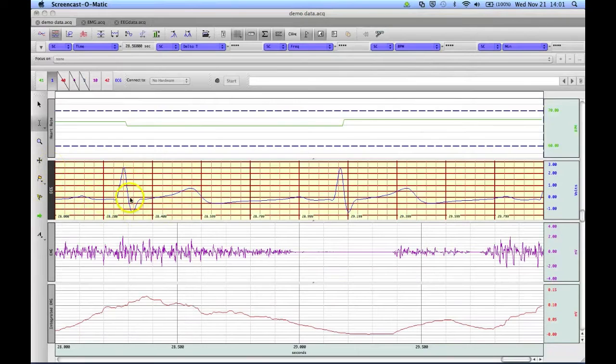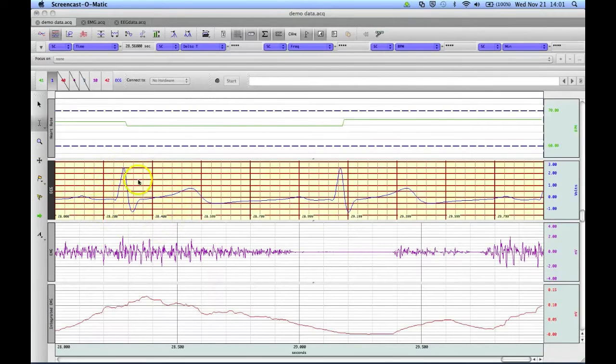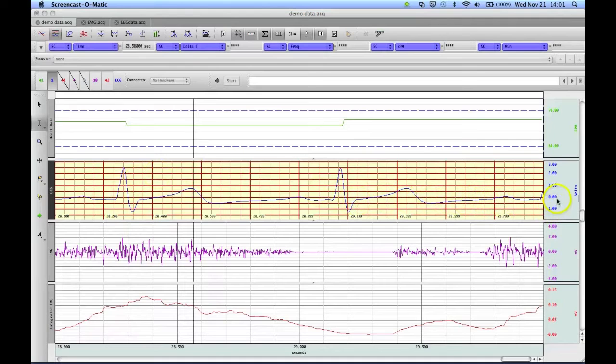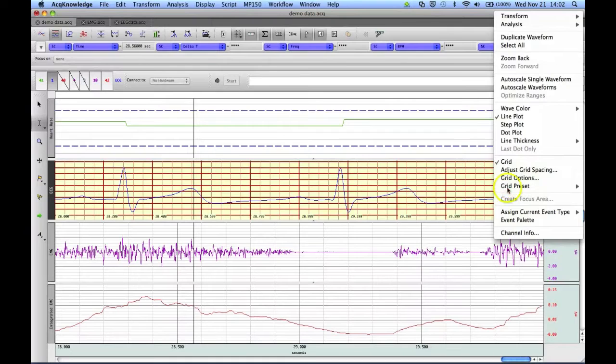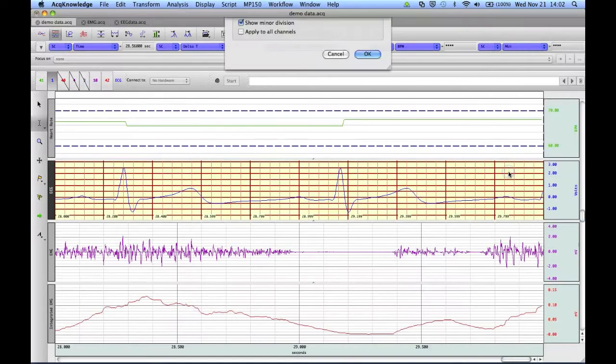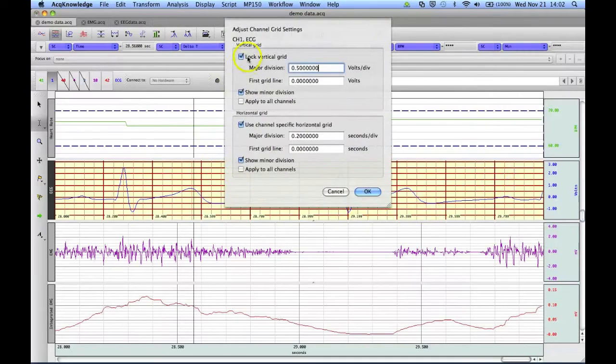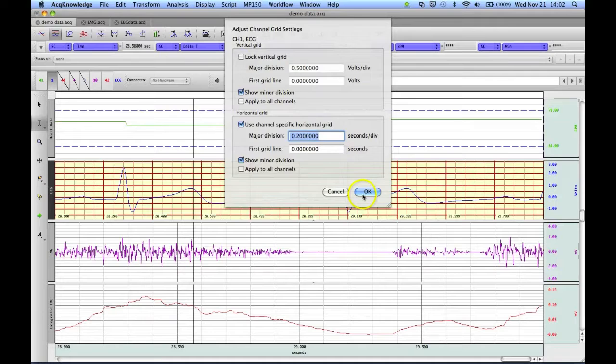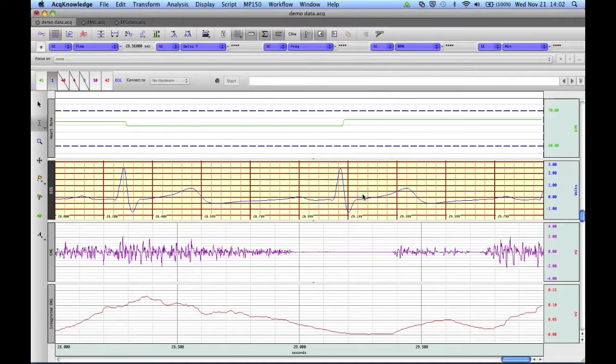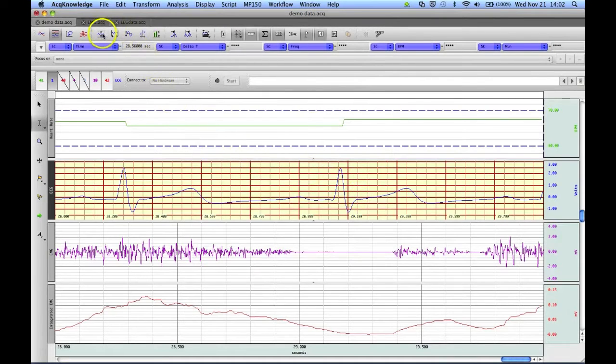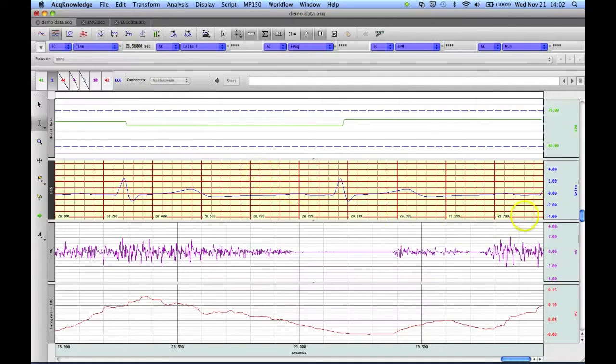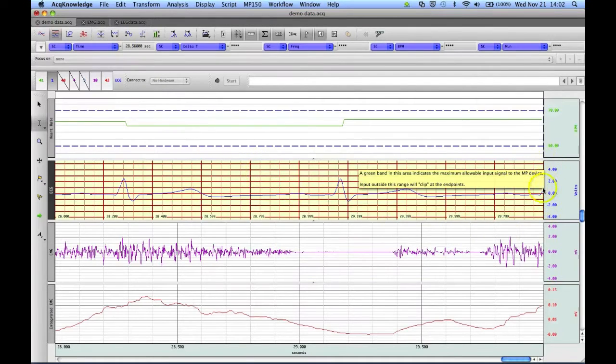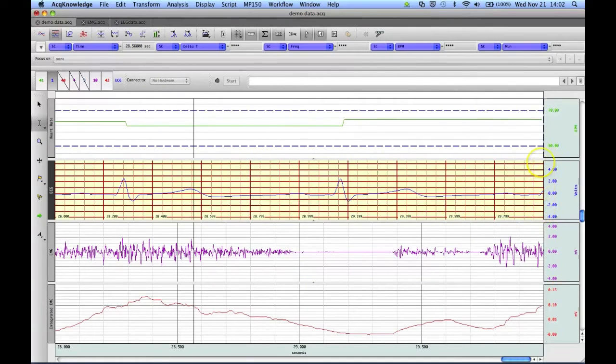if we autoscale our waveform as I just did for this ECG channel, you'll see that because we've locked our grid, it has not changed our vertical division lines. If we were to unlock the grid, and do an autoscale, you'll see that now it's changed our grid divisions.